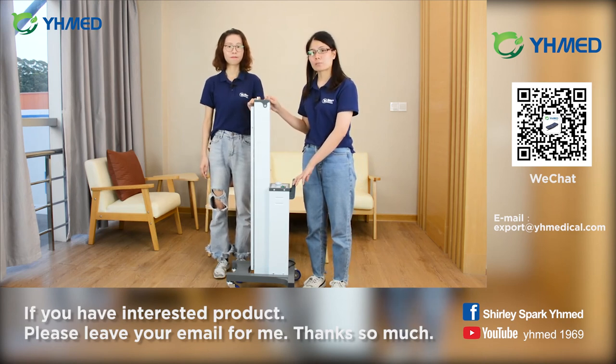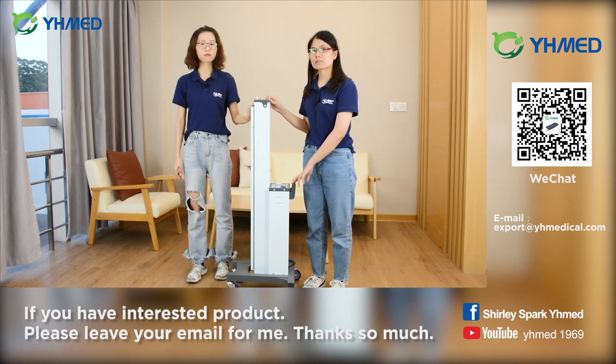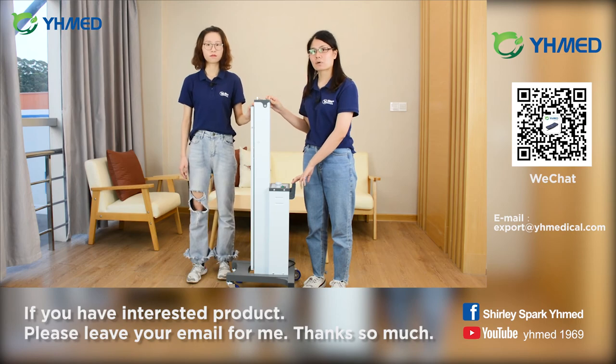Please remember one more important tip. When the machine is working, ultraviolet light is harmful to our body. Please make sure the room is without any people when it is working.